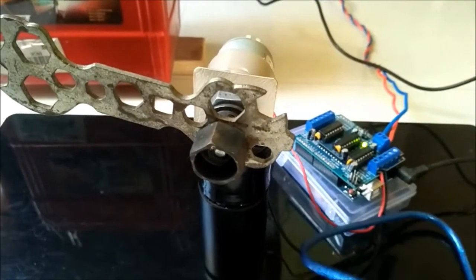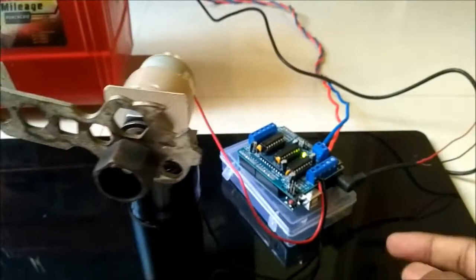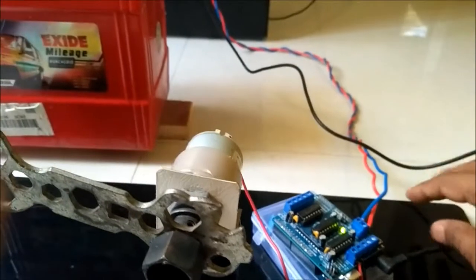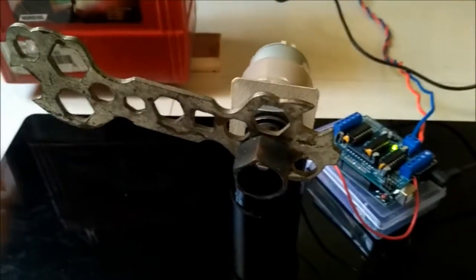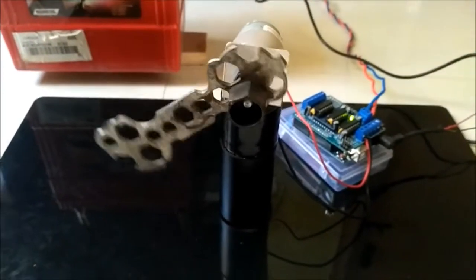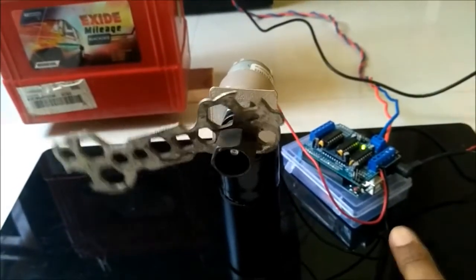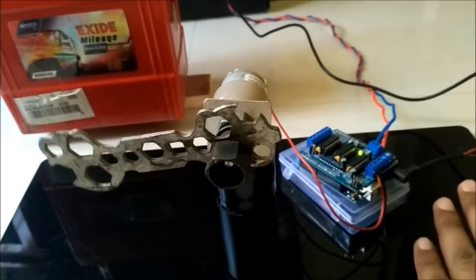Here you see I have removed this data cable where we used to upload this code. Now I have connected a 5 volt DC power supply through our phone charger cable. We'll see how this operates. This is how it's operating now. If you want to change the code, again we need to connect this to a data cable, then code it according to our requirements, and then load it, and then power it separately using the power cable.